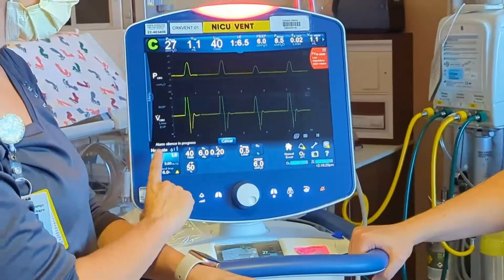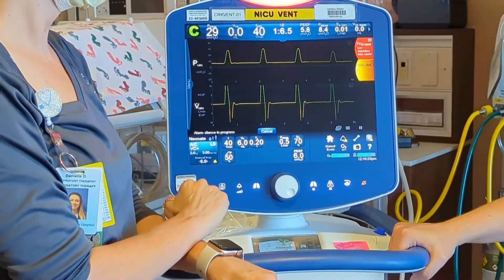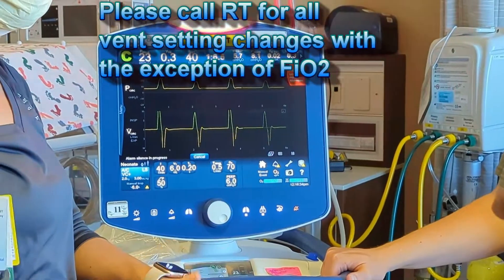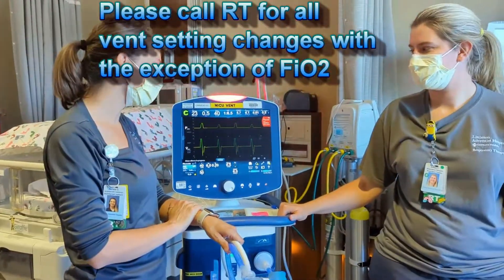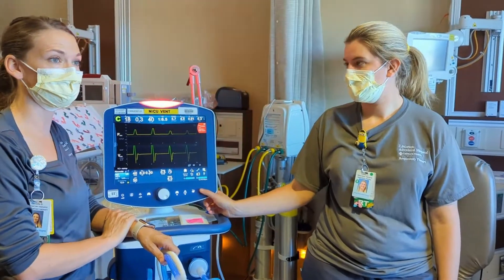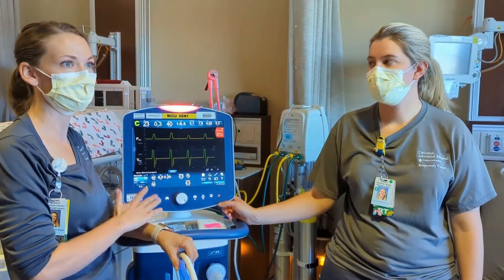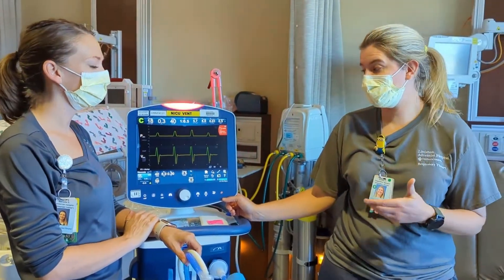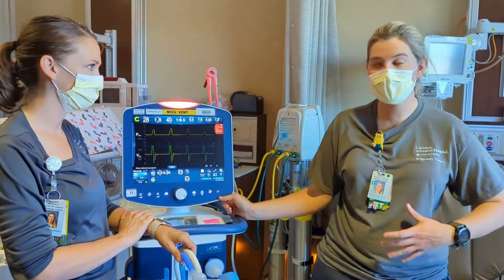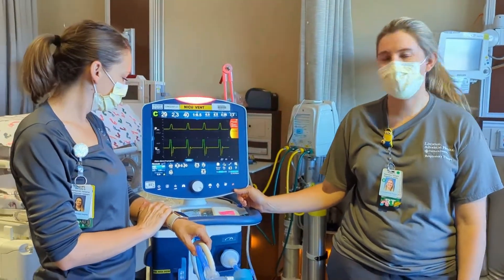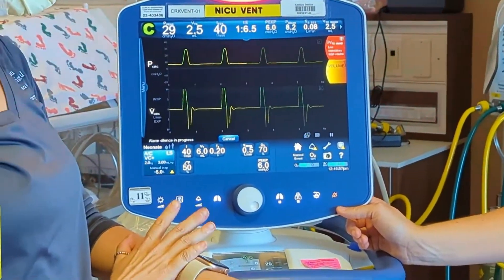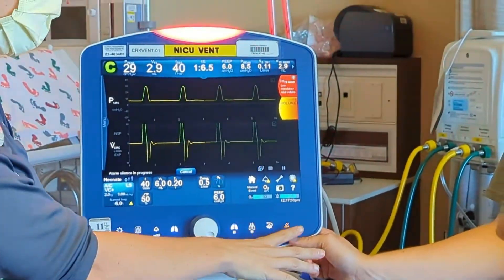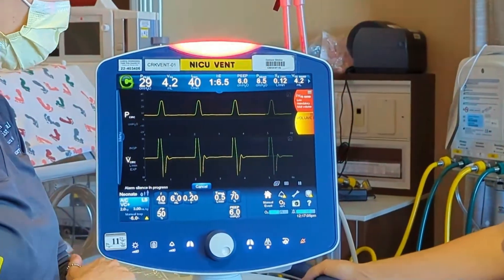The physician puts in orders for what they want the ventilator set to. Sometimes physicians will come and change things on their own or ask nurses to change it. In that case, please give RT a call if the physician makes a change so we can document it and know what's happening with the baby. If they want to increase the rate from 40 to 45, please call RT so we can come make that change. Nursing, you may increase your FiO2 — you have your silence button and your oxygen increase button.